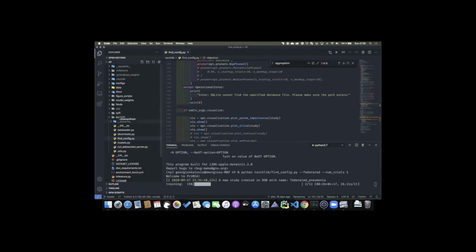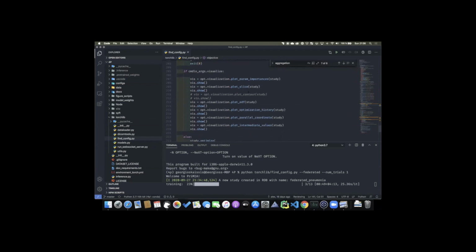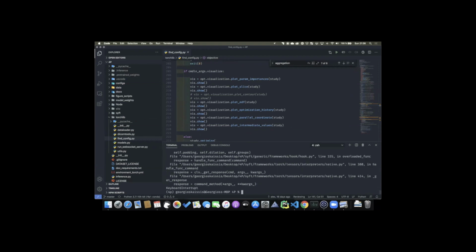database folder. And if you've got multiple CPUs, or if you want to run this on multiple systems, you can actually do hyperparameter optimization over several workers just by pointing multiple instances of this script to the same database file. And that will read the ones that it's already done and smartly inform each other. There's a lot of info on Optuna. This is just functionality from Optuna, which you can find in the Optuna docs. Okay, so that's the 30-minute overview of PriMIA.